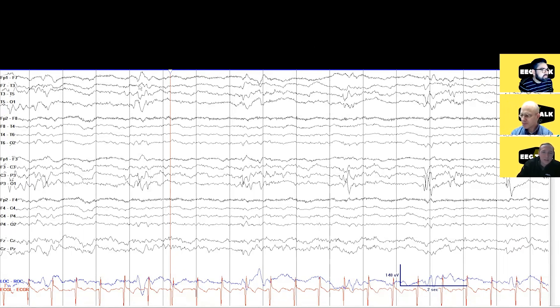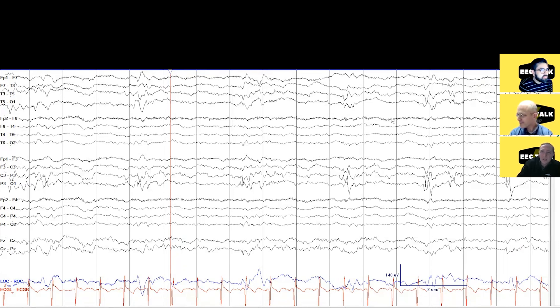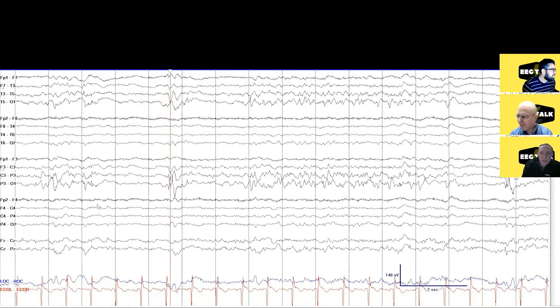When it's coming from one side, we typically use the term lateralized. These are lateralized — and how often are they coming? Each one of these little boxes is one second. So there's one, a couple seconds, another one — it's getting to be about half a Hertz on this page. Maybe it speeds up a little bit. That looks different — it's almost one Hertz.